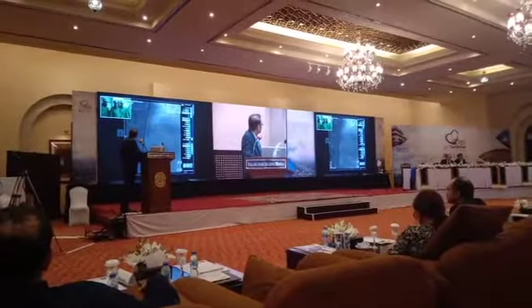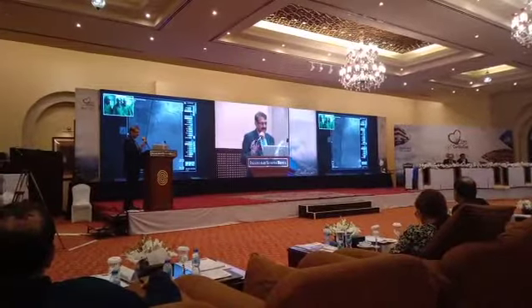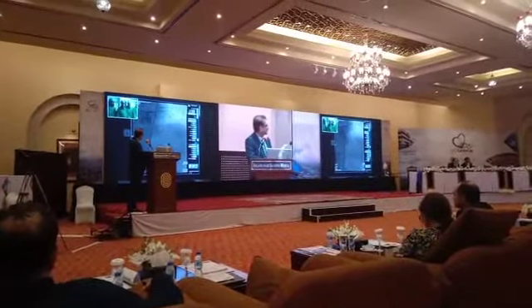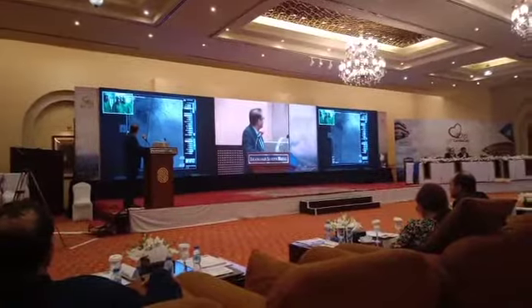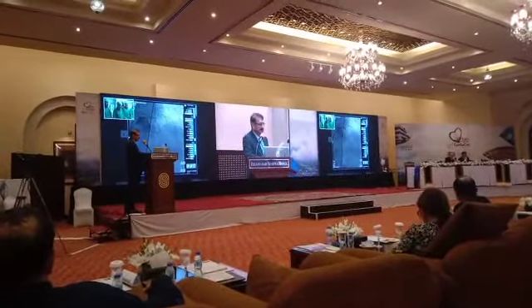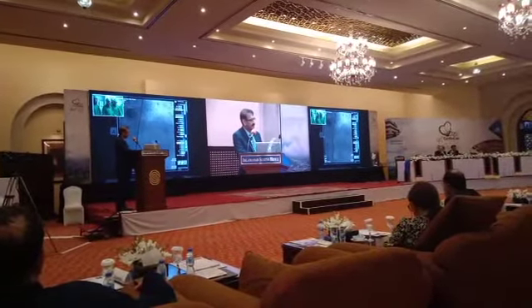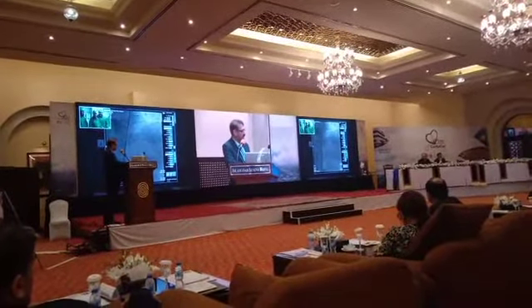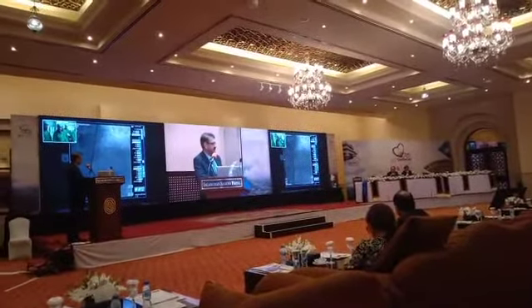So I'd be interested to hear what you think and what the panel thinks in terms of how they should go about treating this. So I'm going to hand back to you, and let's hold the panel, if you like, and see what other individuals will do in terms of treating this lesion. Thank you. So we have Brigadier Nasir Samoor. This is your patient, 65 years old, previous history of 2 stents, diffuse ISR. What will be your approach in this patient?